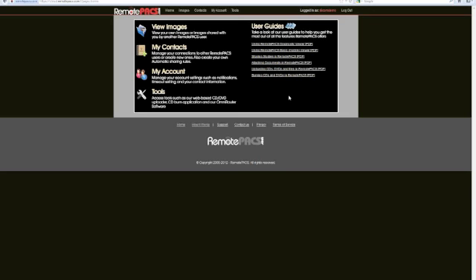Finally, there's a patient account. So if you want to share your images with your patient, you can give them an account, share their exam with them, and they can pull it up on their own, or burn it to a disk and give it to their own primary physician, or whatever the circumstance is. You can give access to just about anybody. And everything in RemotePACS is HIPAA compliant.